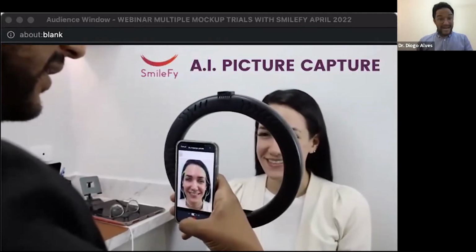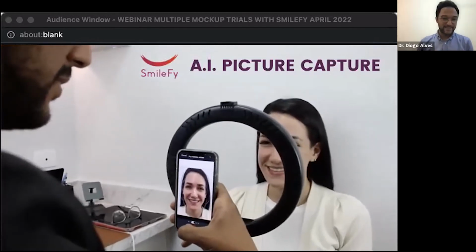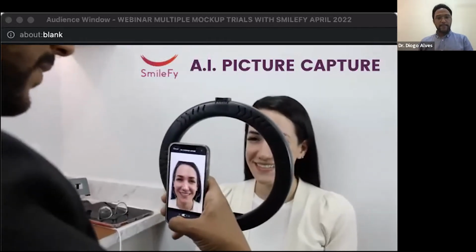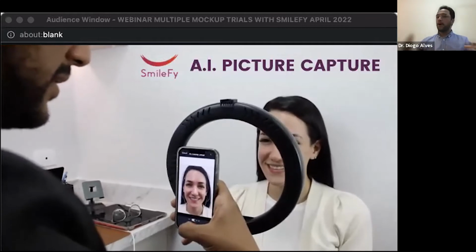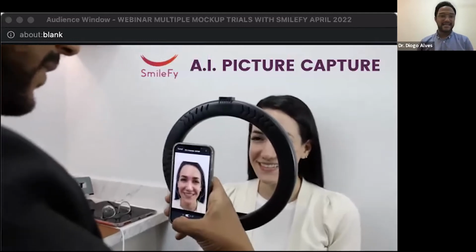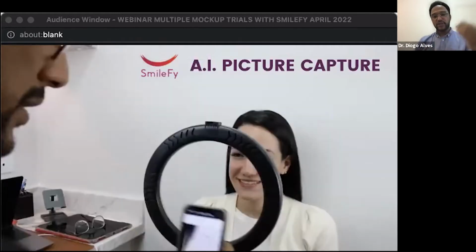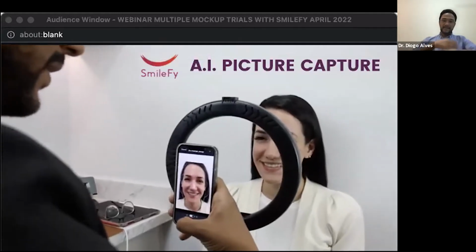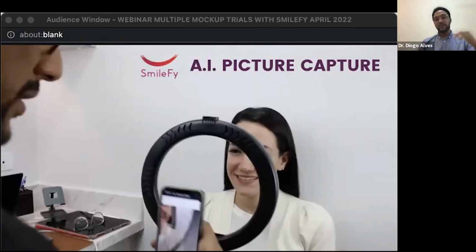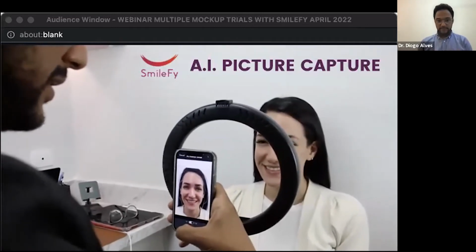So I suggested she do a smile simulation. She asked me what a smile simulation was. I simply told her that with just a picture, I would be able to draft a couple of different smiles so she could help me decide which smile would be the best for her. That already changed the way the patient looked at me and at my office, because I was looking at her desires and showing her new possibilities even before initiating the treatment.